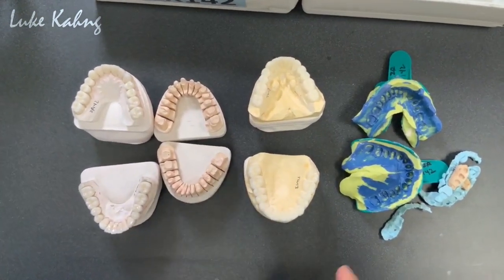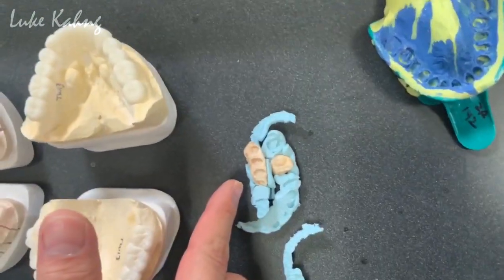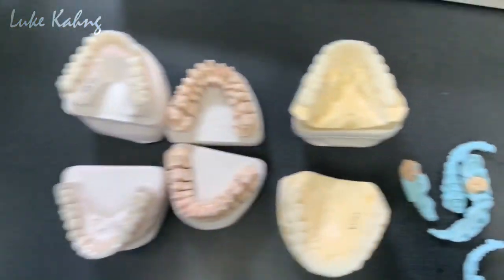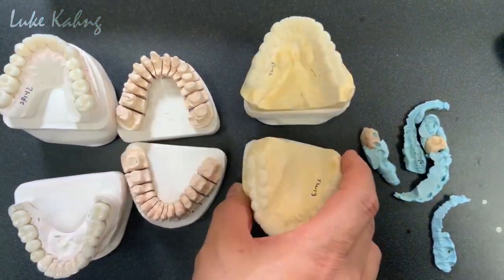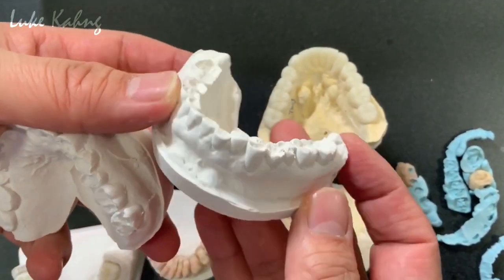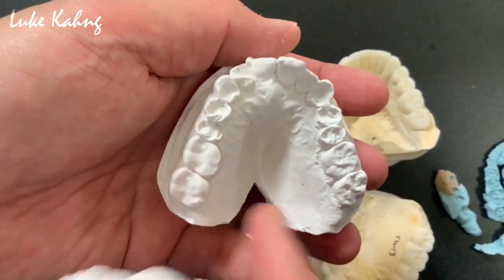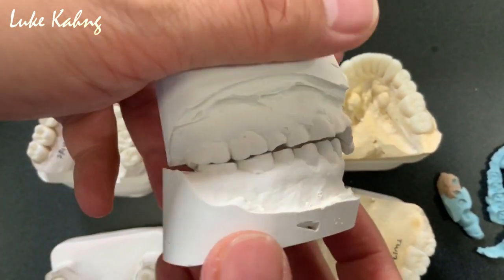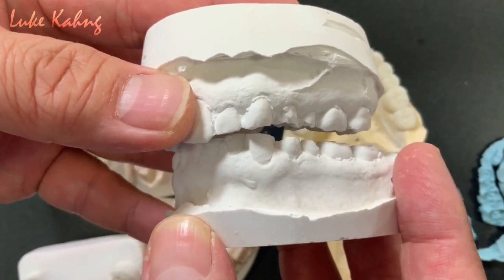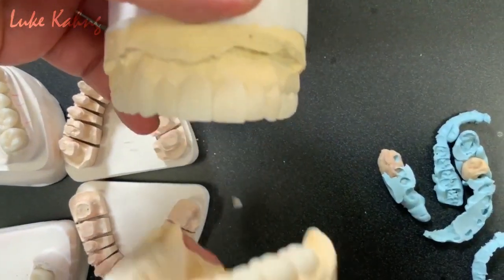Okay, so this is a presentation. The doctor took the impression, and the 28 teeth are in this great bite with the acrylic. It's very rigid, with the prep on top and bottom, which is great. So we made the wax up previously from the old, one dentition. Okay, so everything's gone, and the occlusion is almost flat down, and here is a fake restoration. Here it is too low, so we increase the vertical dimension in order to make a better size of the tooth. So this is after prep, and then we finish the wax up.